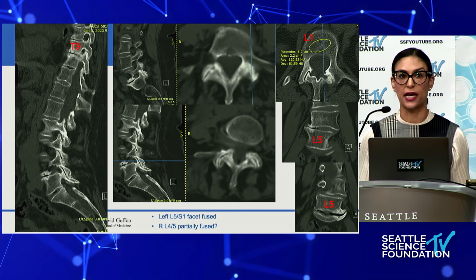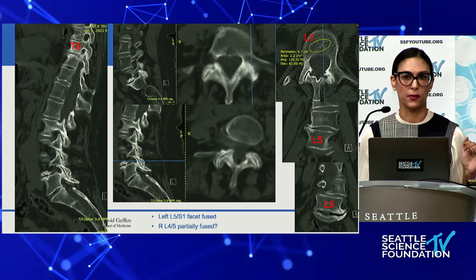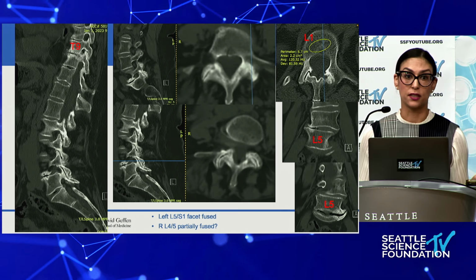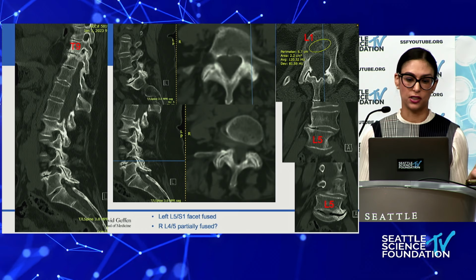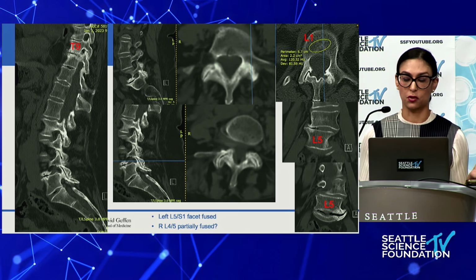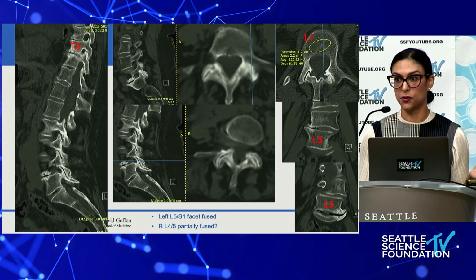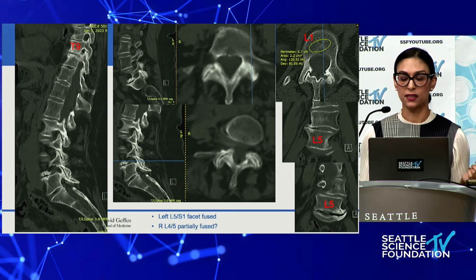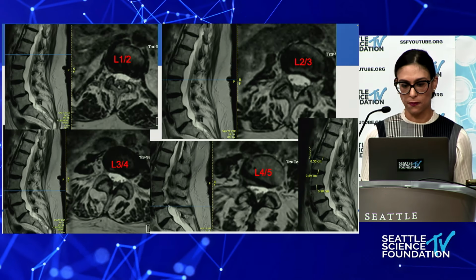Another thing I always check are the Hounsfield units on my CT scan. So again, I had this lady with a T-score of minus 2.6. I put her on 3 months of an anabolic agent. That's usually my minimum. And then I go back and reassess. On her CT scan, her L1 was the best looking one, with Hounsfield units of 120 there. Although I wouldn't call that optimal by any means, that was the best for her. So I thought that would be a good ending spot.